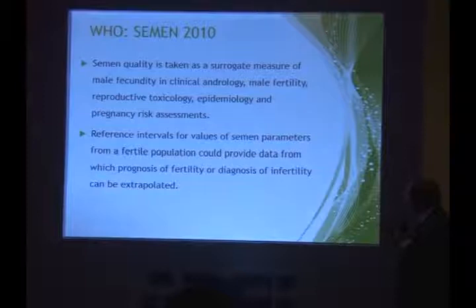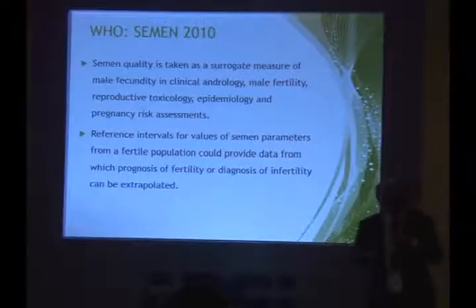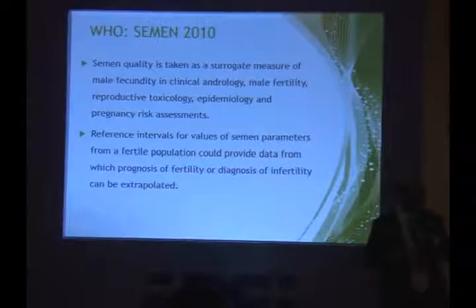Now semen quality is a surrogate marker. It doesn't tell you whether the sperm has the capability of actually fertilizing an egg. Can it tell you? So in a clinical situation, what is the test which can tell you about the fertilizing ability of the sperm?